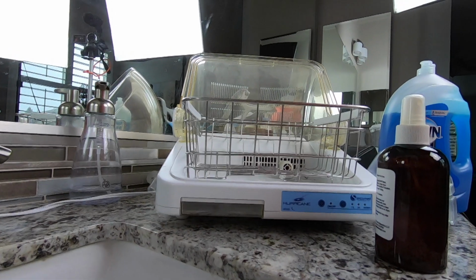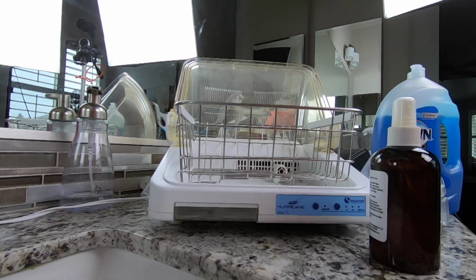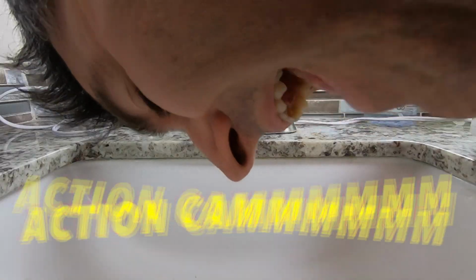This is a method that I also am a fan of, and that's just Dawn dish soap. I think this is something that all DMEs, when they're giving out equipment, instruct people to use, is Dawn dish soap. I also have one other piece of equipment, and that is the hurricane dryer that you see right there. And with that, I am also using the action cam. So you can see exactly how I'm cleaning it in the sink, though it's not touching the sink.